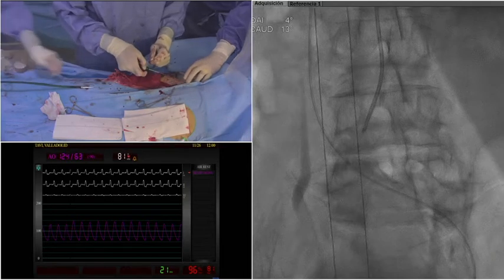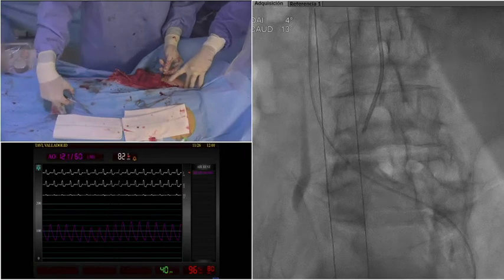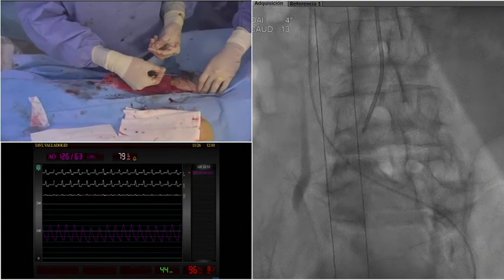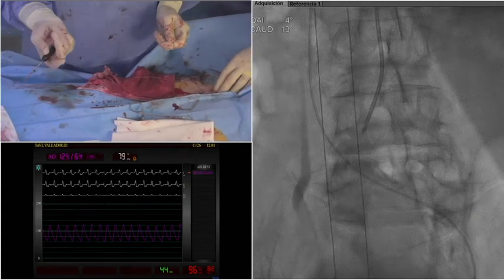So the first one worked perfectly. There is not much bleeding. Still the second one to be in place. And the second one went down perfectly.